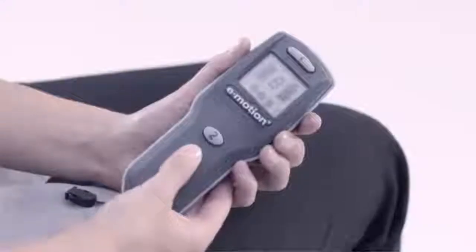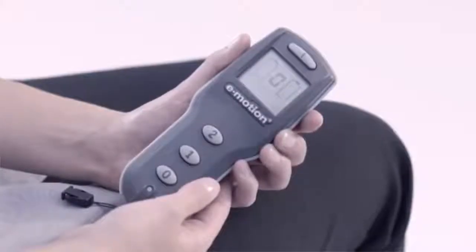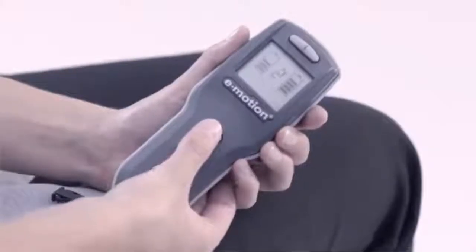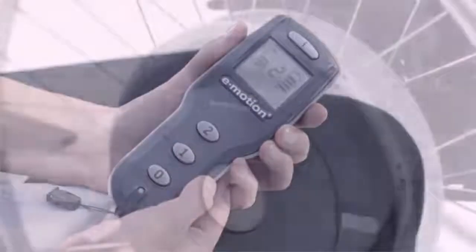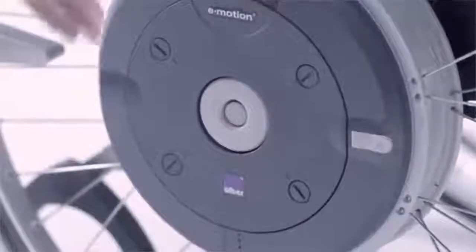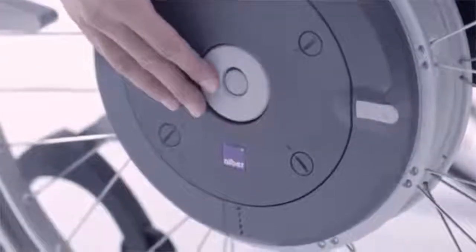E-Motion is switched on and off using the remote control. Two selectable power levels can raise or lower the thrust of the motor. E-Motion can optionally also be switched on and off on the wheel if required.